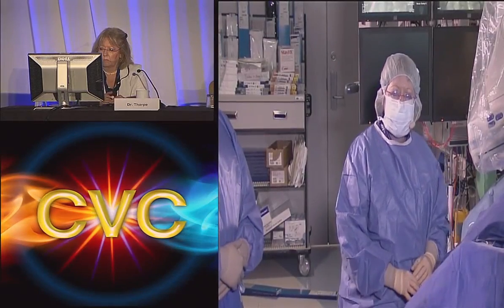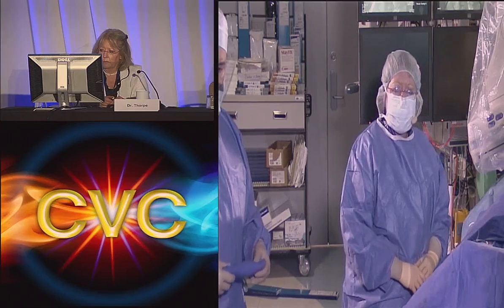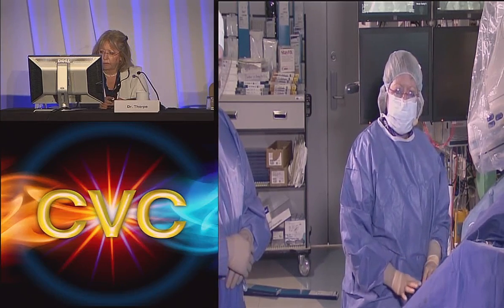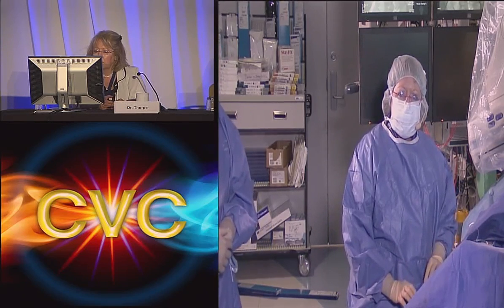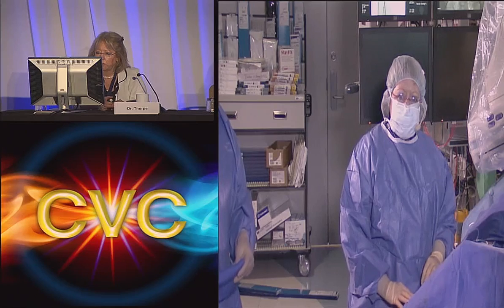Thanks. It's great to be with you today. We're going to show you a case of a May-Thurner iliac compression, which is actually clinically somewhat subtle in certain ways. And what we've done is we've investigated this patient with diagnostic venography and with IVUS. And it somewhat shows how the venogram isn't too impressive, but the IVUS is. So what we'd like to do is introduce this patient.